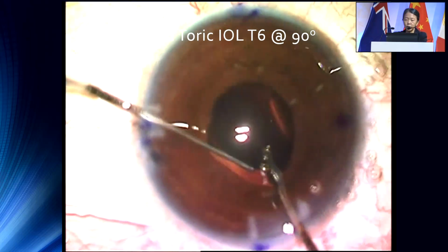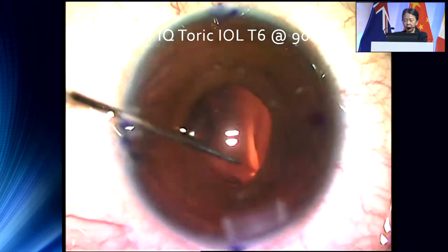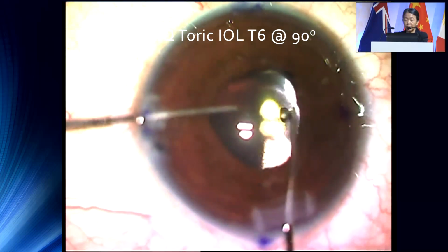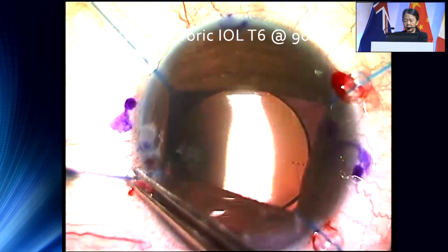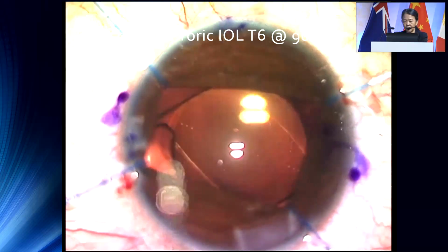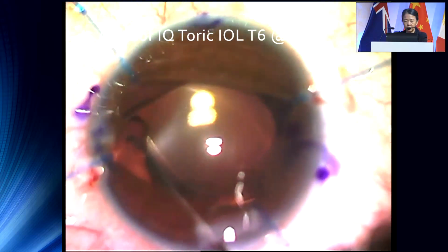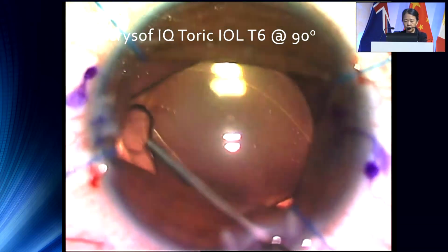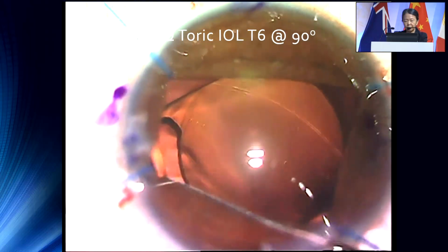Actually, I should have put in iris hooks first because really I just believed her. And I said, I'm going to capture it here. But I need to be sure that the haptics of this lens are actually in whatever bag is left. So at this time, I've actually expanded the pupil. And you can see that this part here, the capsule actually has run out. And I'm going to put the haptic in.